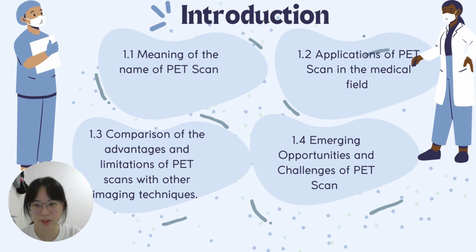and blood flow trends. Compared to CT and MRI, which focus on structural imaging, PET specializes in observing functional activities, and the combination of PET with CT or MRI integrates structural and functional information, providing more comprehensive results. However, PET scanning faces challenges, including high equipment costs, radiation exposure, image noise interference, and the need for improved image reconstruction algorithms, all of which require further research and technological advancement to enhance its clinical utility.